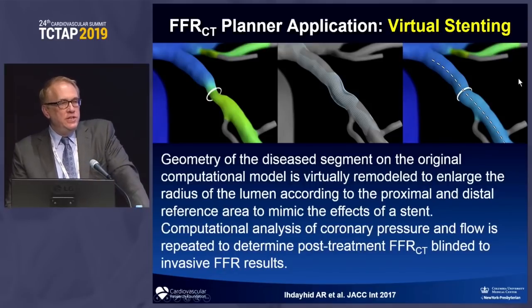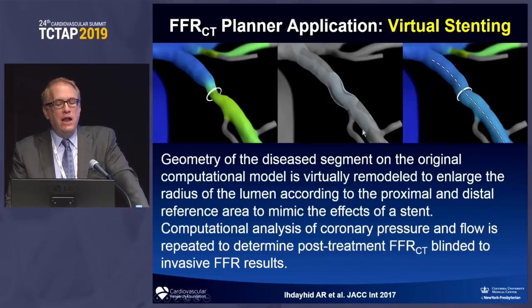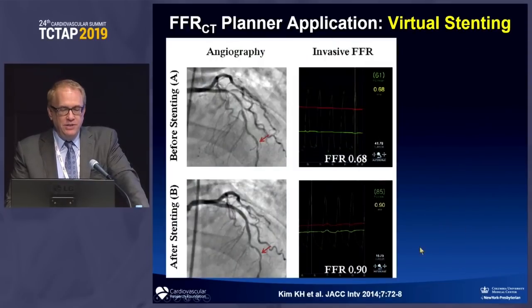Another thing that you can do with this technology, which has recently been submitted to the FDA for approval, is what's called virtual stenting, or by use of the interactive FFRCT planner. And that is, you can take a stenosis and then mathematically model what would happen to it if you put a stent in it and basically eliminated the stenosis, and then calculate the new FFRCT.